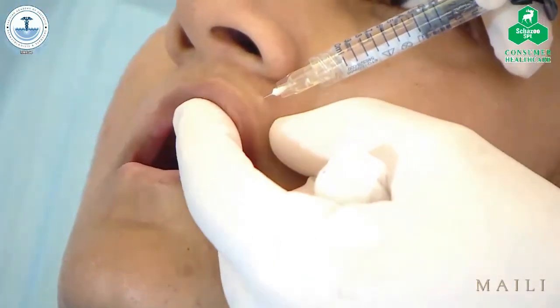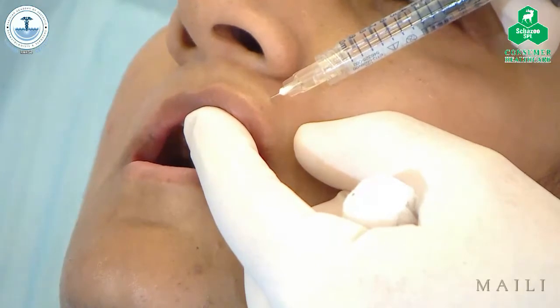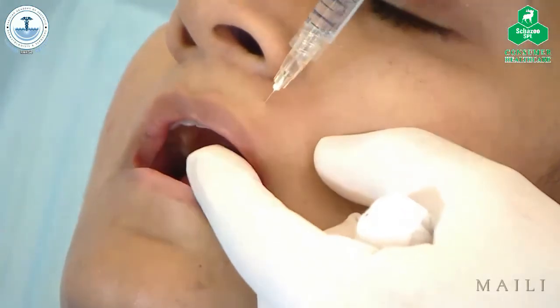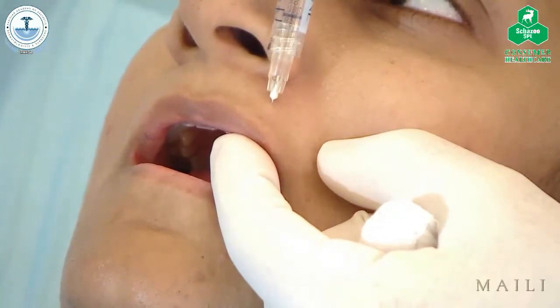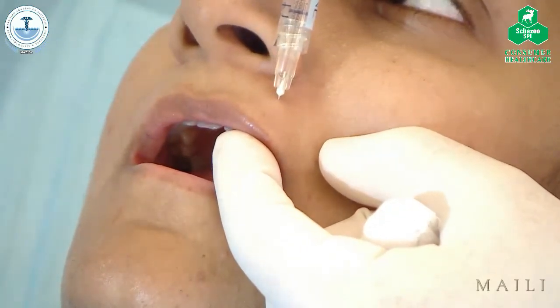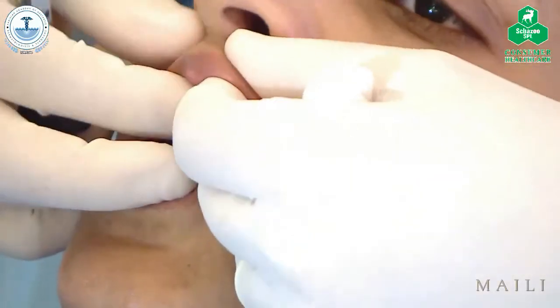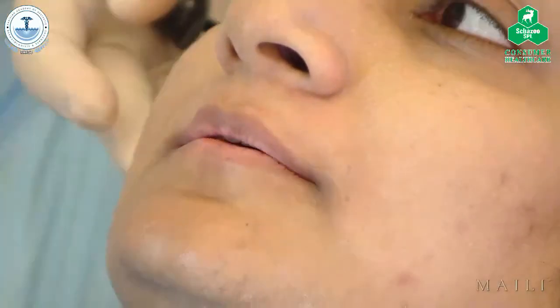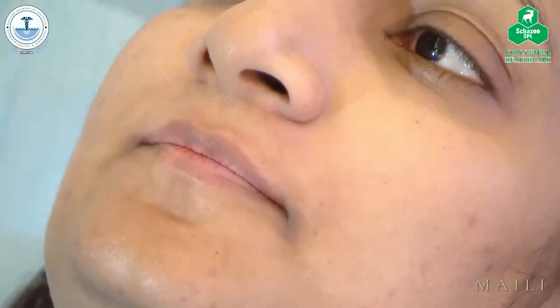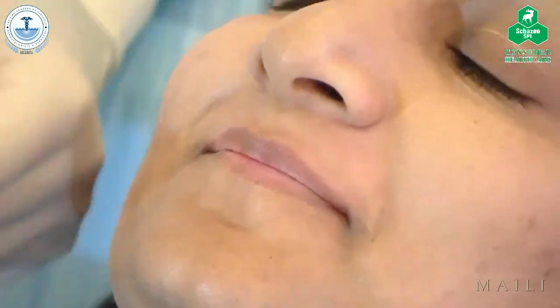Okay. Again, under the cupid's bow. 0.05. Directed downwards, 0.05. And then I just massage it to make sure it's even. Okay? And you can see it's everted. Very, very natural. Guys, this is not a circus. It's just using the anatomy. You know, it's very simple.